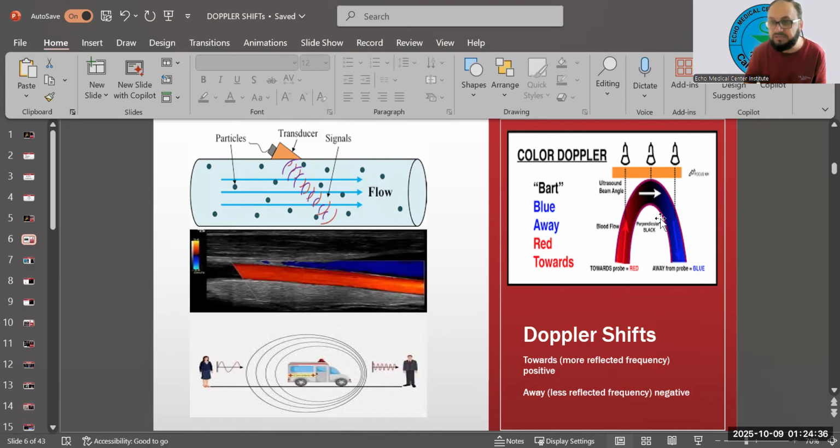Again, somebody may ask you that question: what will select the Doppler shift in the frequencies? Is it the operating frequency or the receiving frequency? Remember, it's always the receiving frequency. Because look, here was 10 megahertz, and here was also 10 megahertz on the operating side. But here you get more reflection in the receiving frequency. Here you get less reflection. Again, it's the receiving frequency.